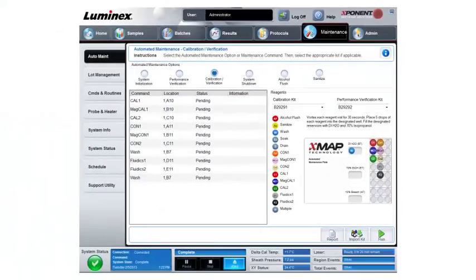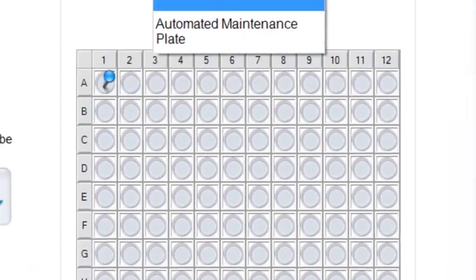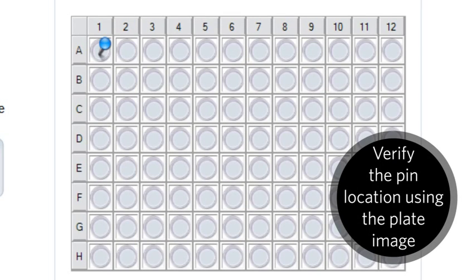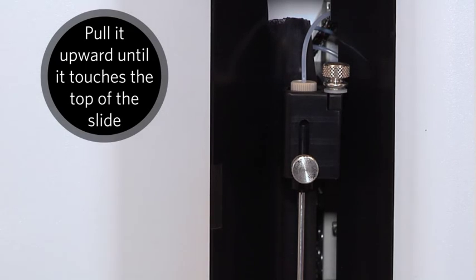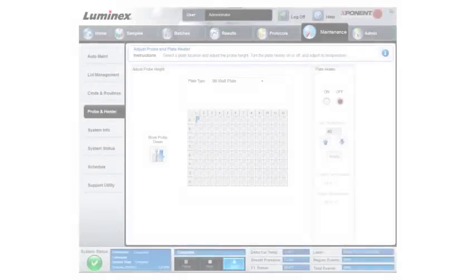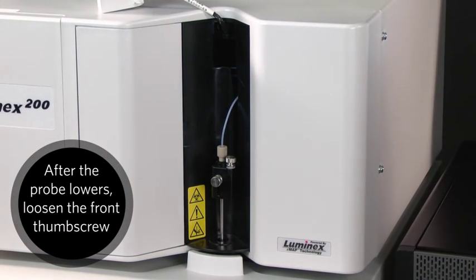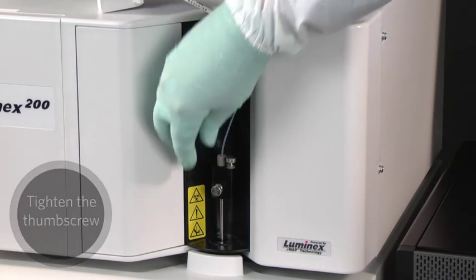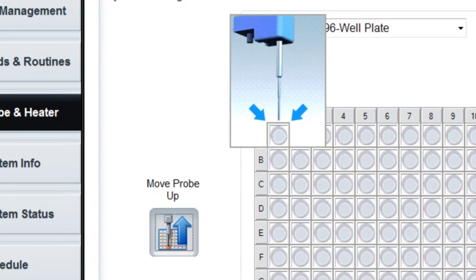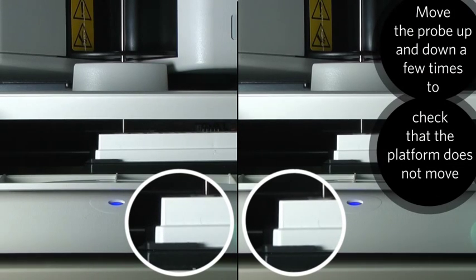Ensure that the plate type is set to 96-well plate. On the plate image, verify that the pin is on the correct well location. Loosen the front thumbscrew on the probe holder one-third to one-half turn. Pull it upward until it touches the top of the adjustment slide. Tighten the thumbscrew. In the software, click the Move Probe Down button. After the probe has finished lowering, loosen the front thumbscrew. Gently push the probe down until it rests on the top of the alignment discs or sphere. Tighten the thumbscrew. Click the Move Probe Up button. It is easy to put too much pressure on the probe when setting the height — move the probe up and down a few times and watch to see if the platform moves when the probe touches. It shouldn't move.